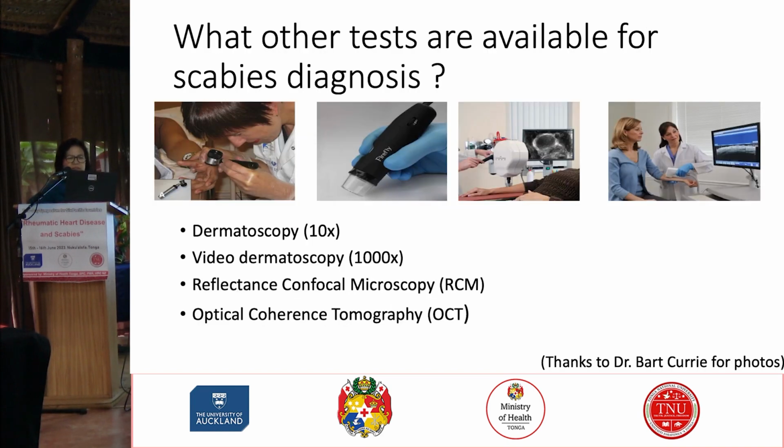Other tests that are available: clinicians, dermatologists, would use a dermatoscope, but the resolution is low, it's 10x. Higher resolution is by video dermatoscopy. And in high-end facilities, you can do RCM or OCT.